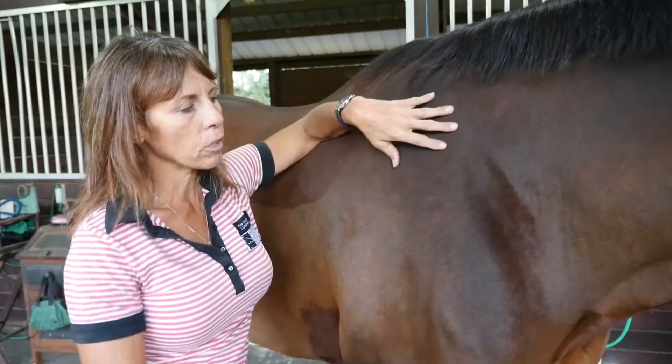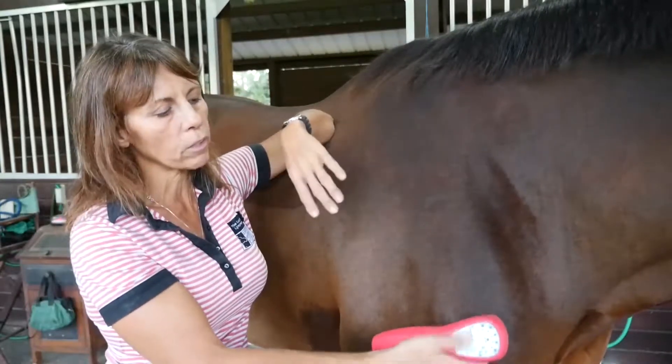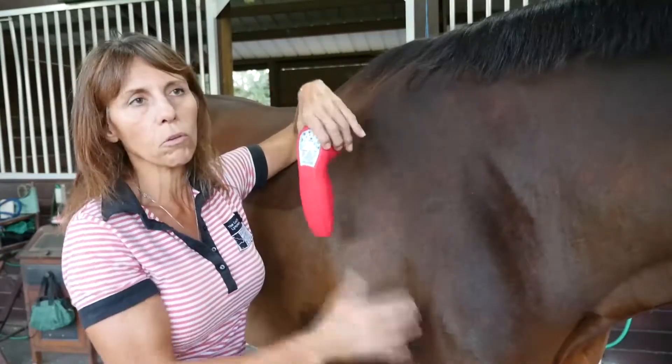You really want to get that inflammation out. You might even treat the glenohumeral joint for inflammation, and then come back in and do your protocol with the sweep for the muscles over that area to try to stabilize the glenohumeral joint again.